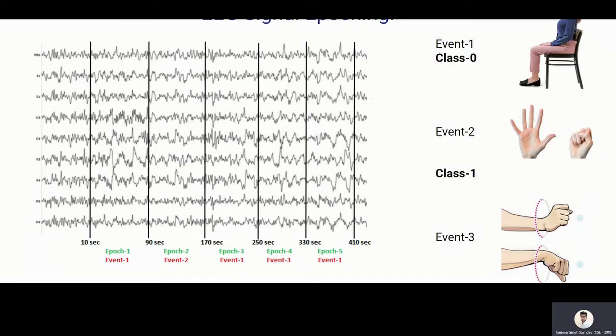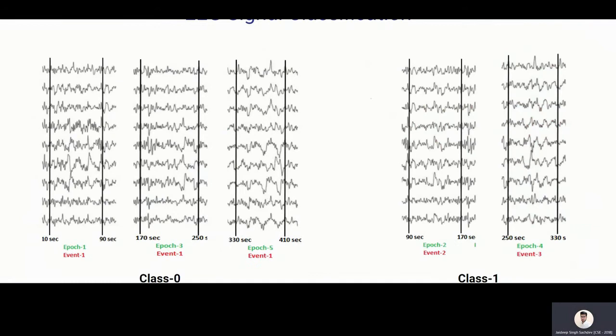So event 1 is nothing but a steady state, means the person is not doing anything. And event 2 is a state where a person is moving his hands, doing some actions. So what I did is that event 2 and event 3, I have combined and created a class 1. And event 1 is class 0.